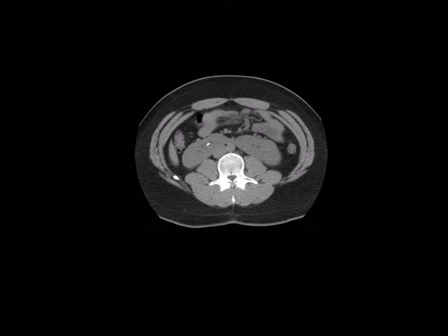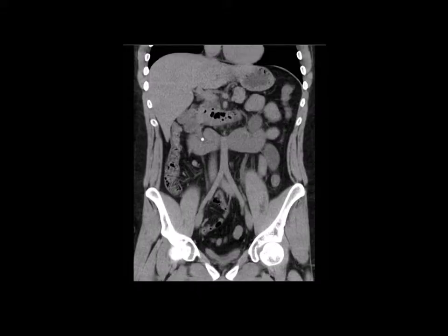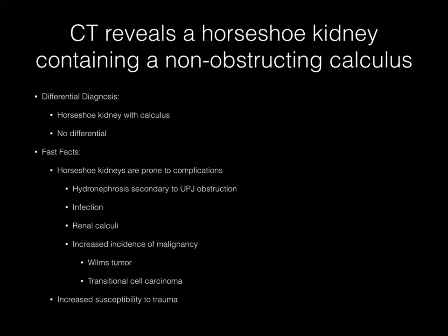Now pause your media player. Axial and coronal CT images without IV contrast demonstrate a horseshoe kidney containing a non-obstructing calculus. The diagnosis is horseshoe kidney with renal calculus. There really is no differential diagnosis here.